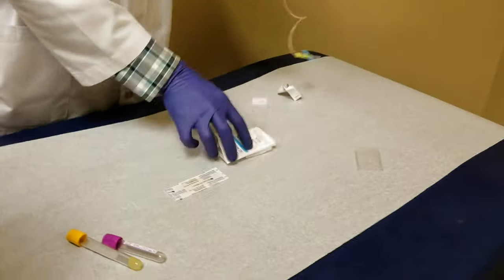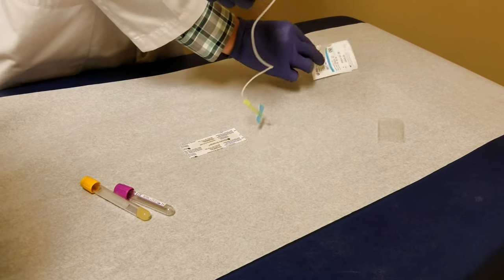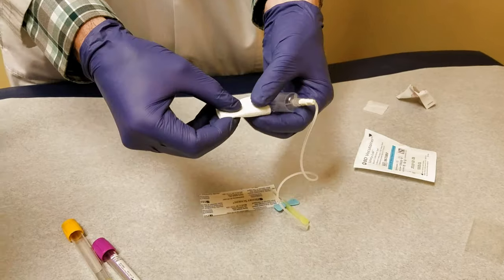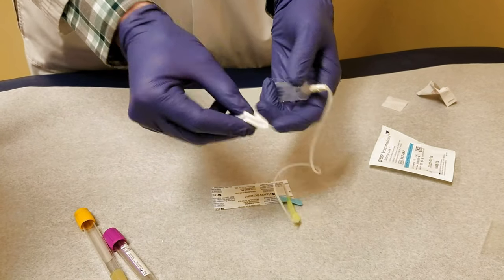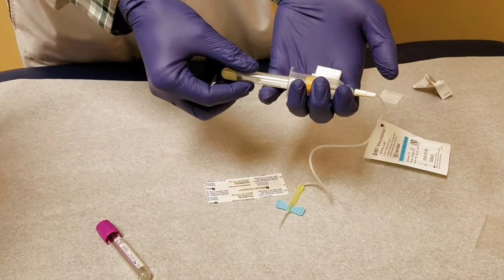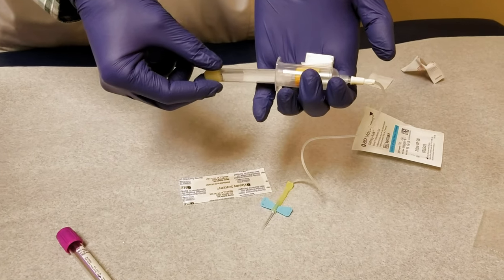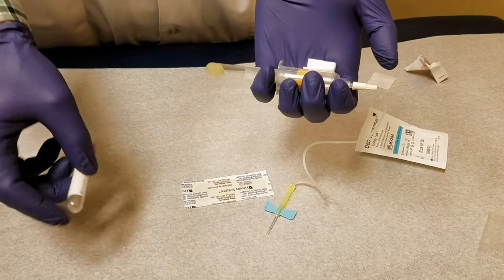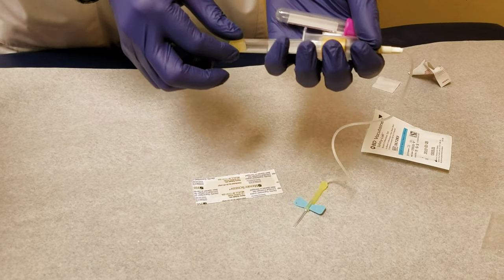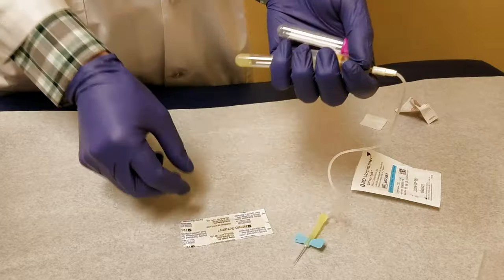Get one little piece of gauze — not a lot, just a little bit — and hold it in your hand. Take one hand, put the tube in but don't push it all the way in, just so it's holding there loosely. These tubes have vacuums, so you don't want to break the seal just yet.